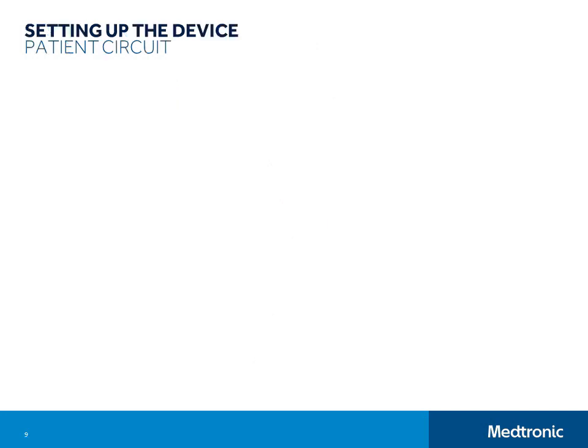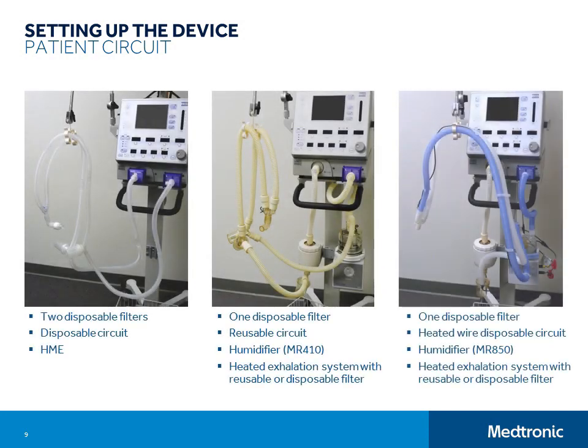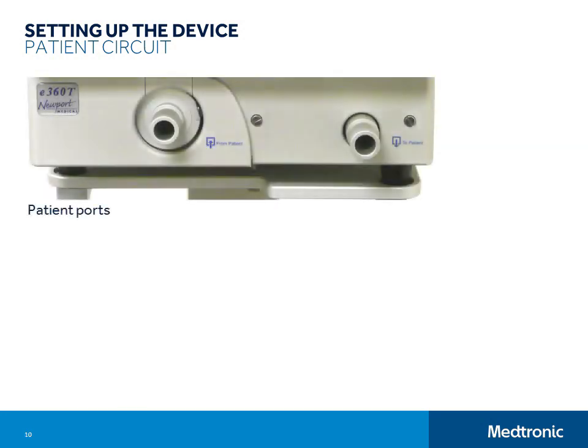To get the ventilator ready for patient use, you will need to install the breathing circuit system. Breathing circuit system configuration requirements vary from institution to institution and from patient to patient. Your patient breathing circuit system configuration will need to match your institution's policies and individual patient needs. Let me take a minute to orient you to the layout of the tubing ports before we go over attaching the breathing circuit system. You will notice that there are labels on the tubing ports that say 'to patient' and 'from patient.' These labels indicate the direction of flow, so tubing going to the patient will connect to the port on the right and tubing coming from the patient will connect to the port on the left.